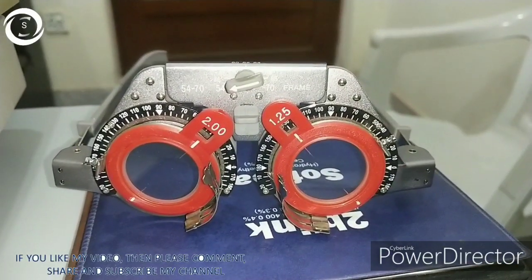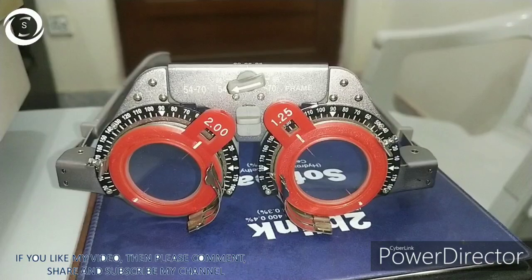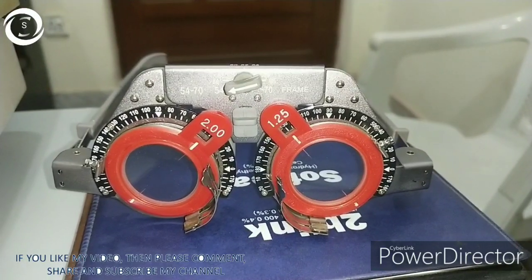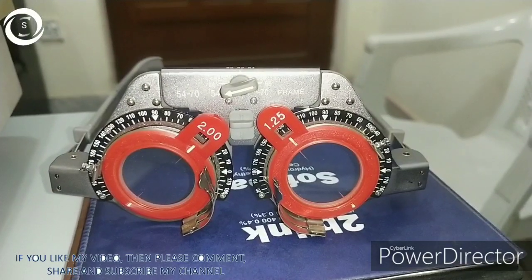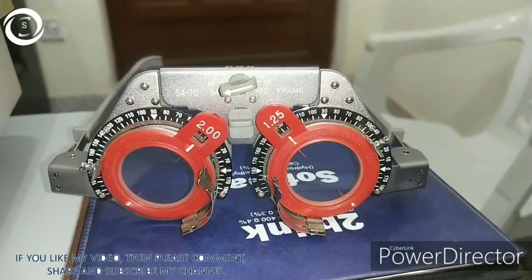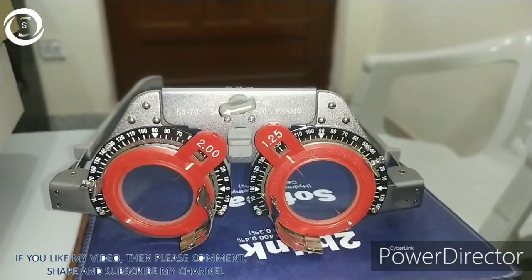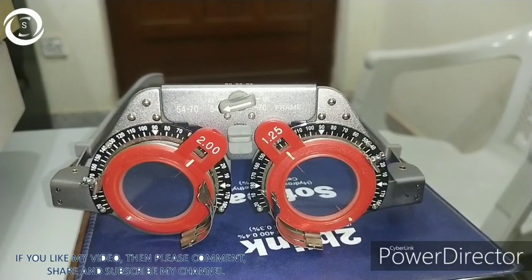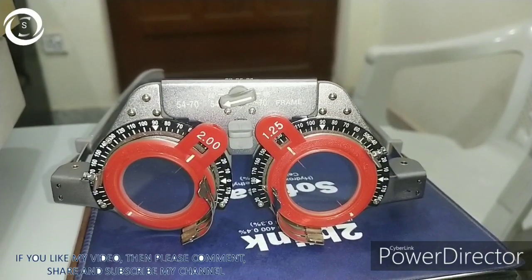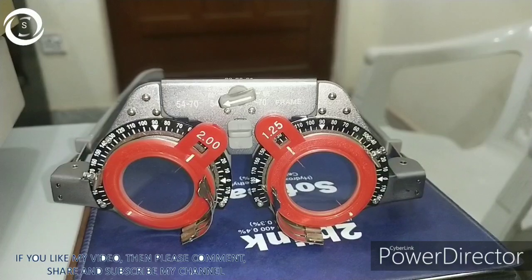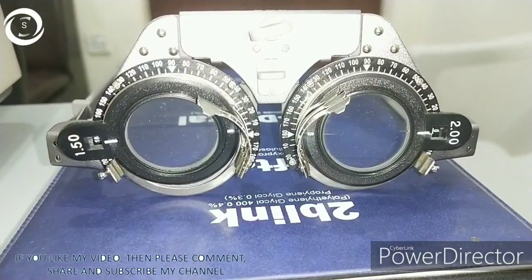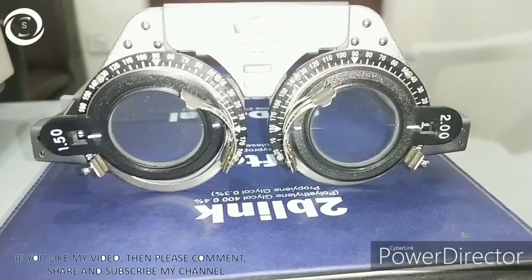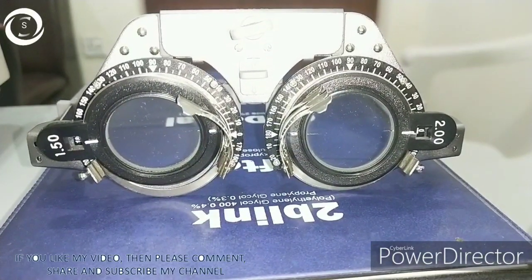Now the third patient has both axes facing each other symmetrically on the trial frame. So if you find little deviation on auto ref and patient is not happy with that, you can apply this rule and patient may get clearer view when you face both axes each other or apart. The fourth patient has got 180 degree axis both eyes.